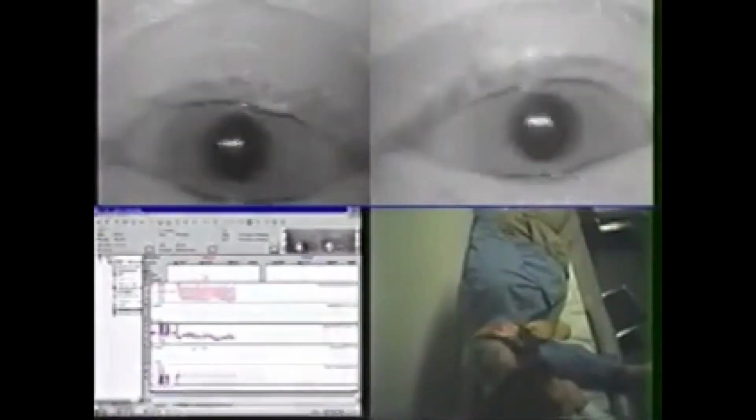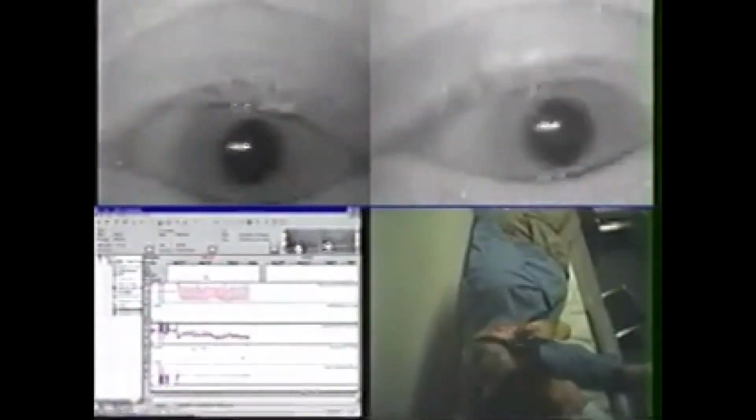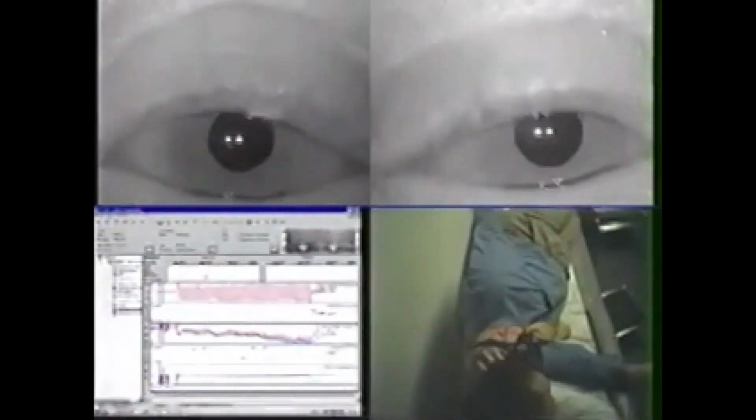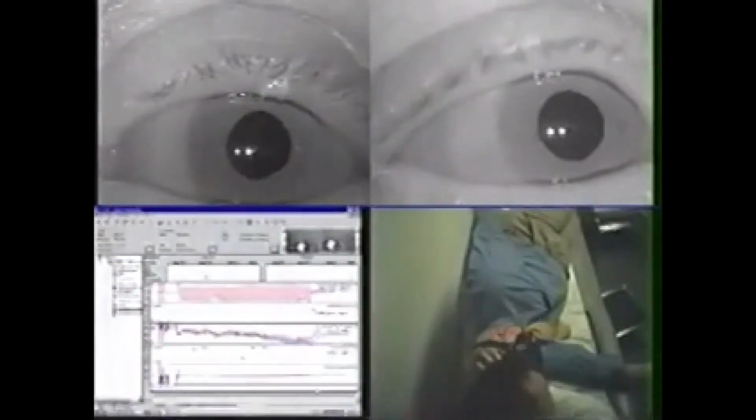The patient here is lying on their right side. The goggle is covered and they will shake their head back and forth at 2 Hz for 20 seconds. Post-headshake, you can see a right beating nystagmus. We know this patient has a left unilateral vestibular dysfunction based on this test, his symptoms, his history, and other tests we have completed in the test battery.